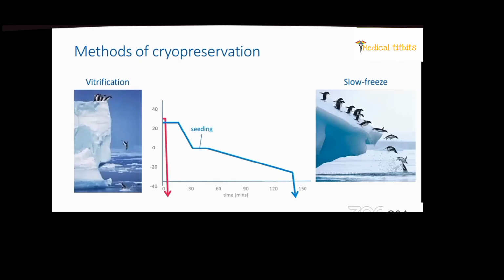There are two main methods of cryopreservation of human oocytes and embryos that have been used in IVF labs for the past few decades: slow freezing and vitrification. Both techniques are based on the principle of dehydration. Slow freezing involves a controlled slow decrease in temperature with a slow increase in osmolality around the cells and requires a rate-controlled freezer.